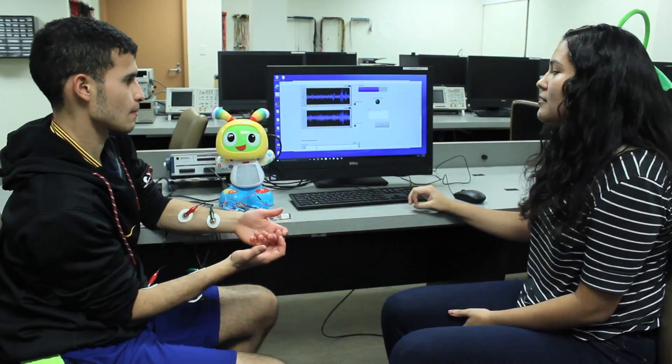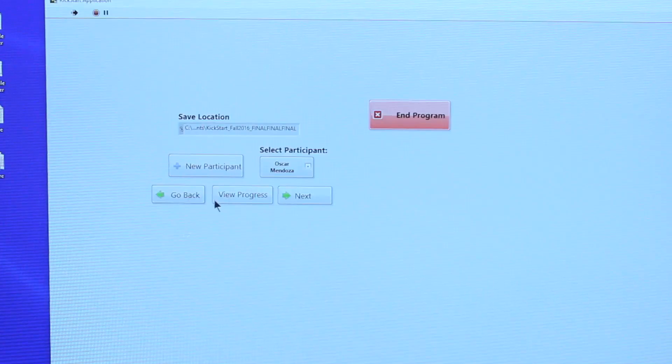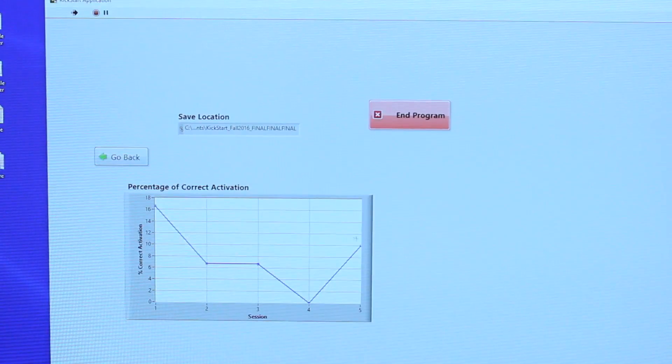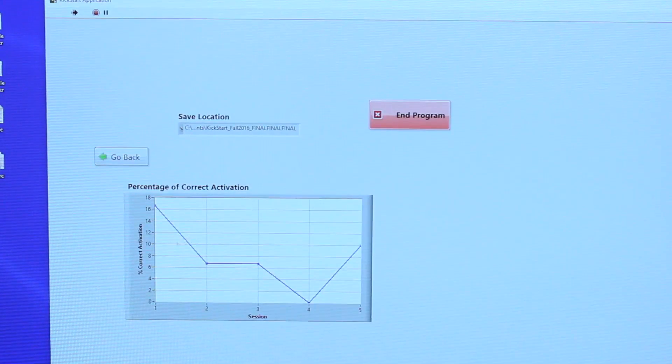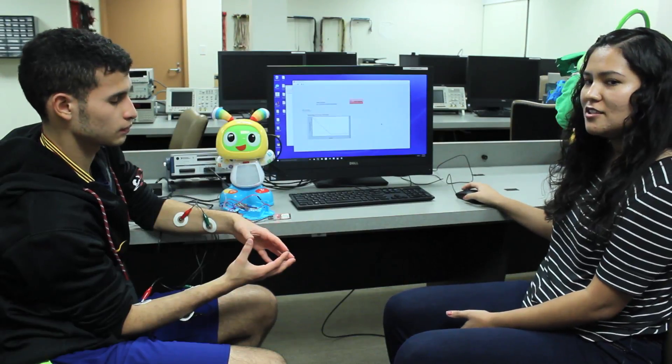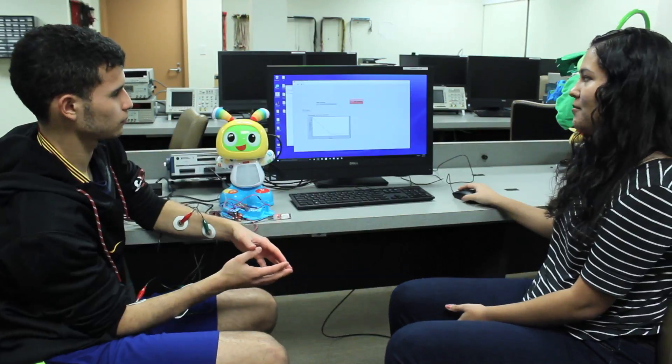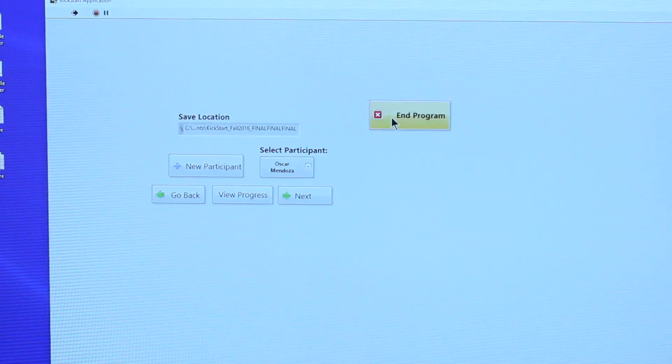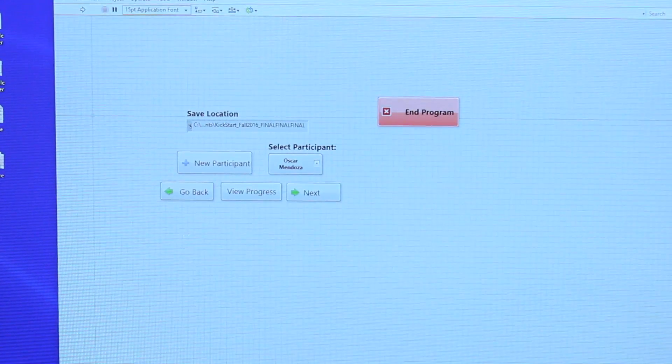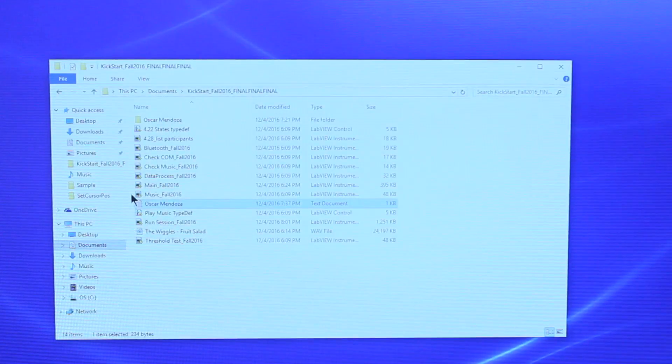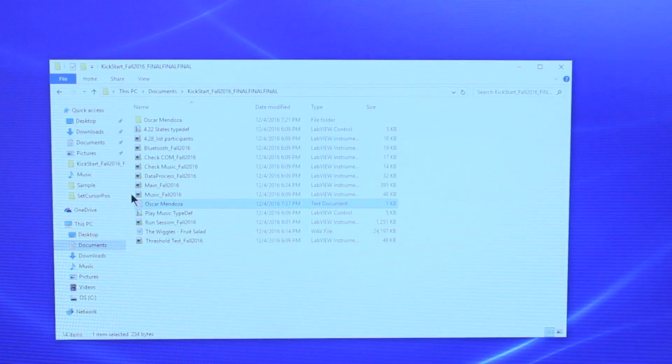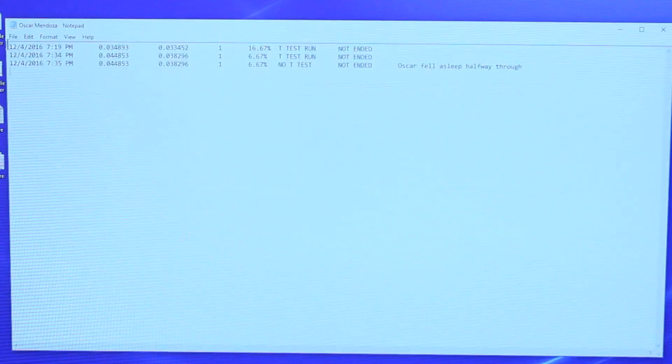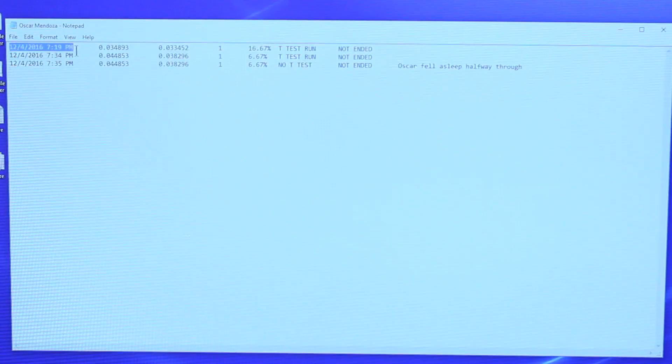You can view the progress of consecutive sessions in this option here. Now that you're done with the session, you can end the program. The data from the session will be available in the folder where you designated the save path. There will be a .txt file that contains information such as the date and time of the session, the threshold values, and how long the session was.